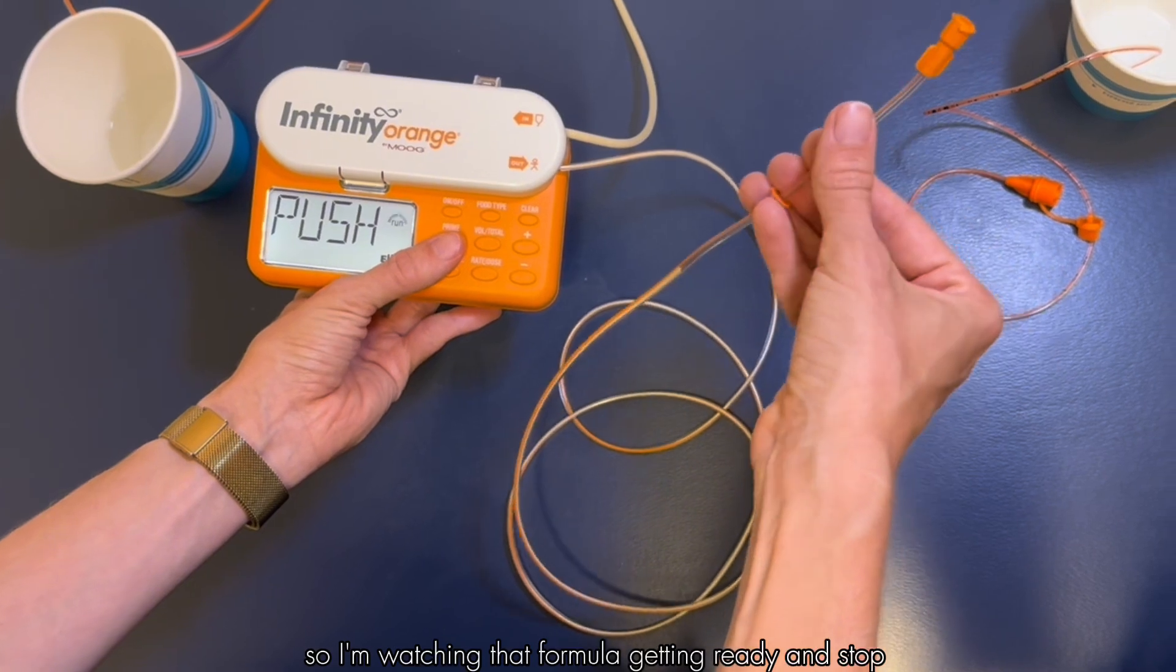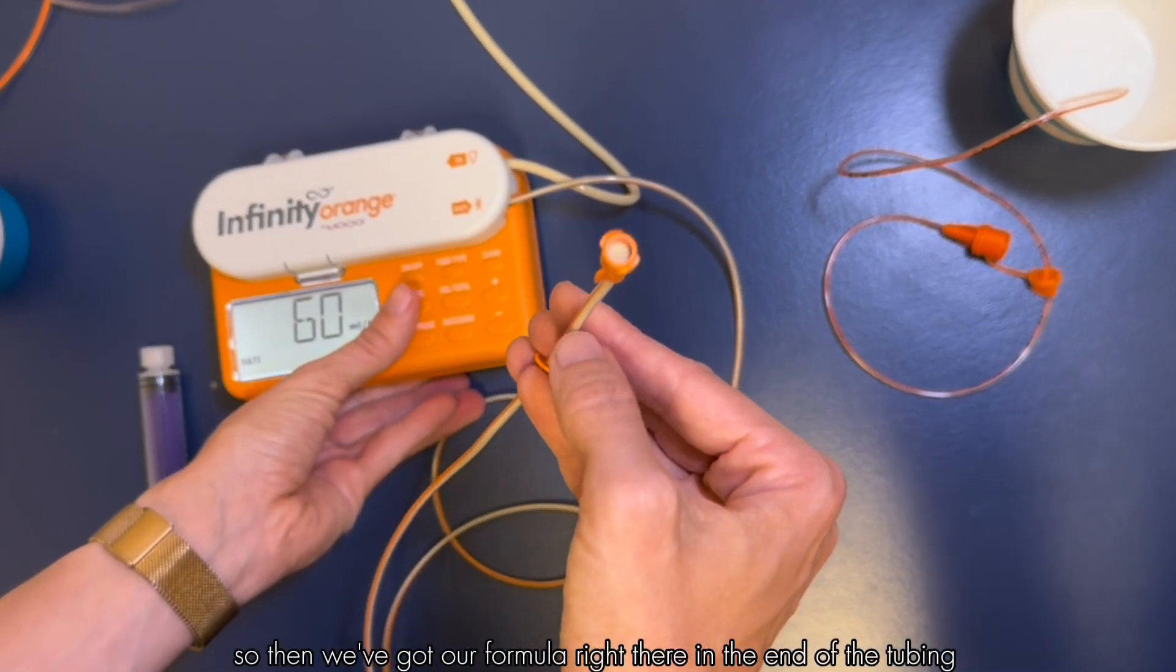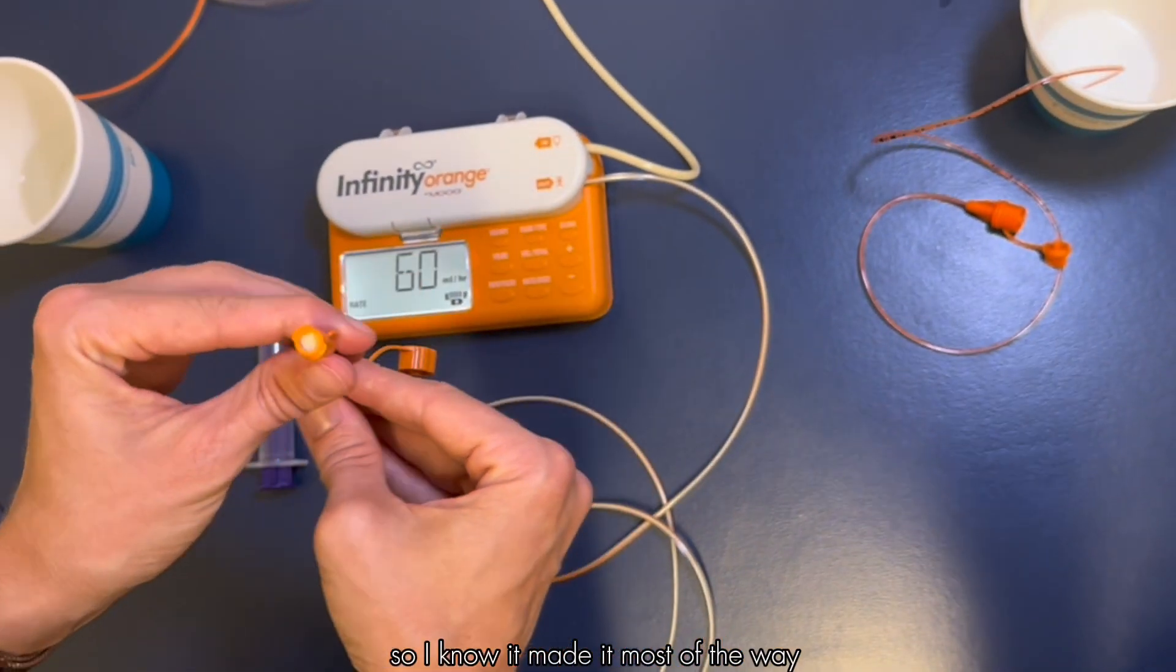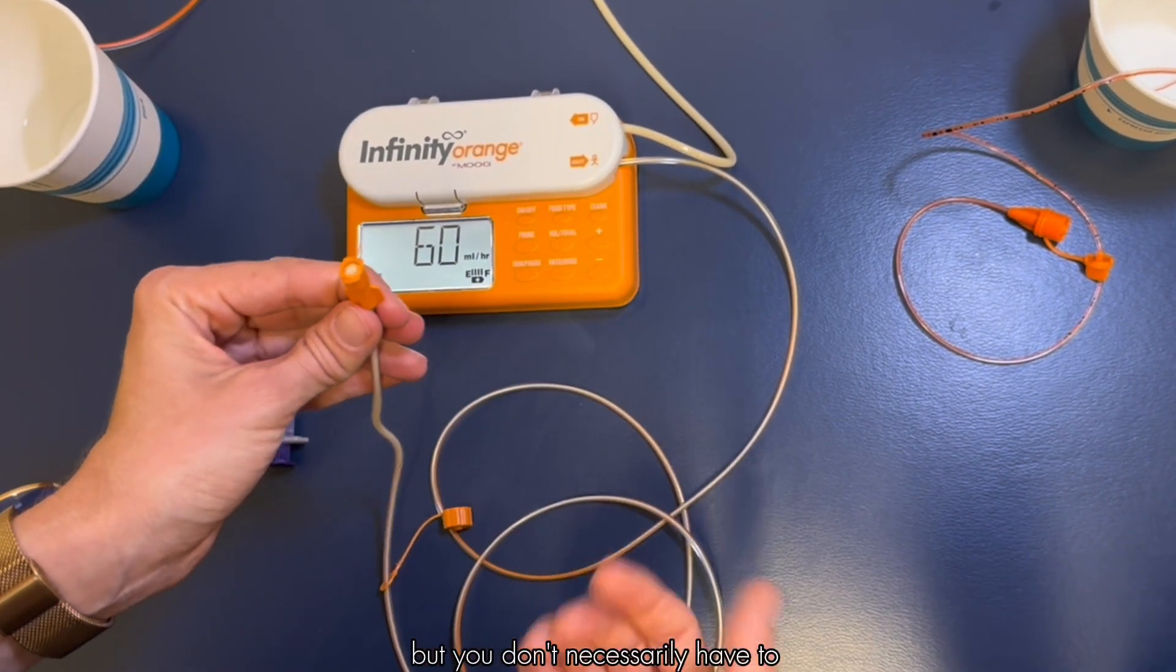I'm watching that formula getting ready and stop. So then we've got our formula right there in the end of the tubing so I know it made it most of the way. If you want to let a couple drips come out that's fine, but you don't necessarily have to.